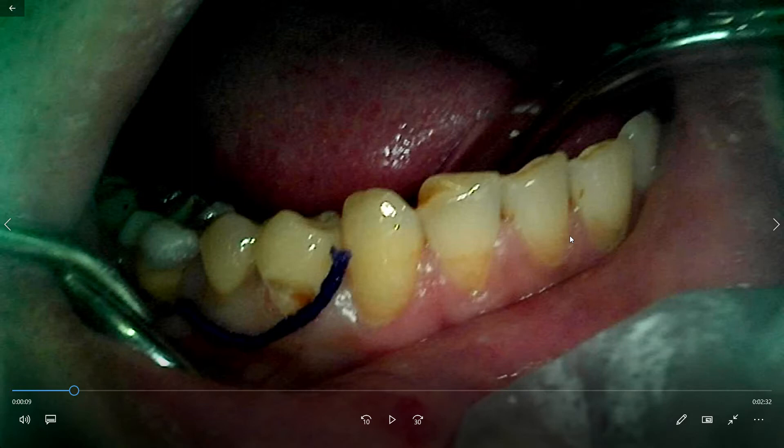If it is a thin biotype, the thin retraction cord is selected. And if it is a thick biotype, then the thick number 1 retraction cord is used.